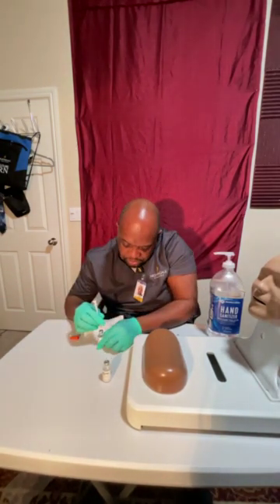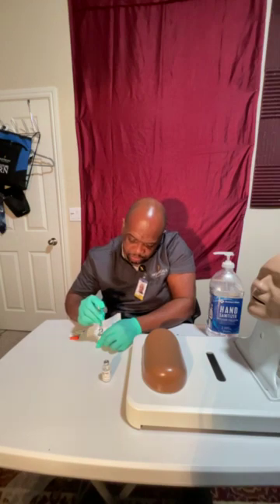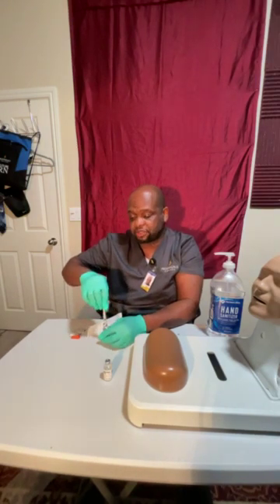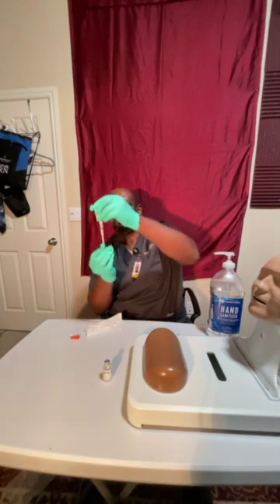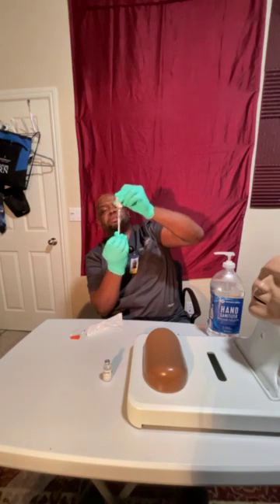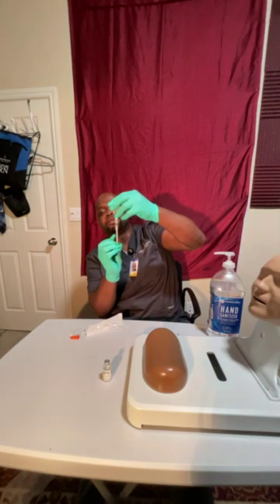All right. So then from there, I'm going to gently put that into the medication bottle, and I'm going to inject the 4 units of air into the regular. And the purpose of that is the amount that we put into the bottle is the amount that we're pulling out. Now, at this point, I'm going to invert the bottle, and I'm going to pull out 4 units. Okay, 4 units of insulin, the regular. Right above the 5.